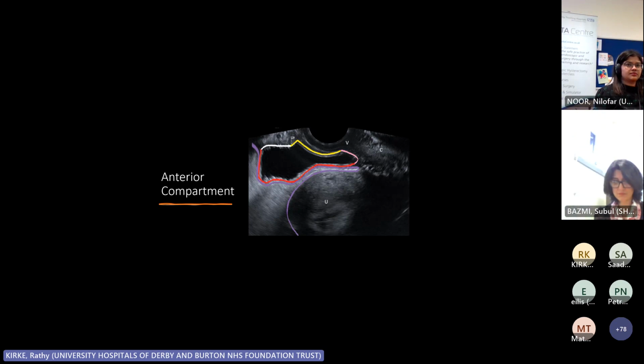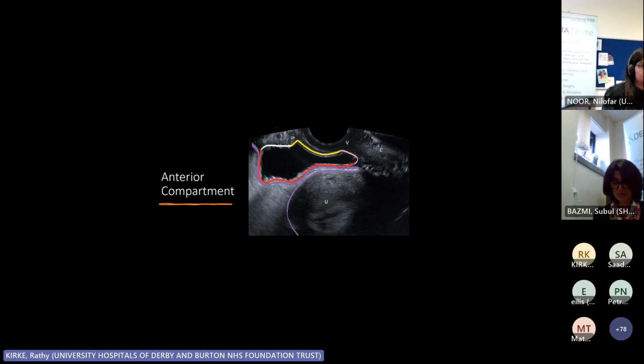Someone recently told me that when you scan a patient for endometriosis, think like a gynecologist. I thought that was too complicated for me. I thought, no, thank you. I'm just a simple radiologist. But I think it made sense, because that's what you do with an internal exam. They move the uterus, they're feeling the posterior space, the anterior space. That's the sort of feel you try and get with the ultrasound. We look at the anterior compartment and just get a feel of how is that uterus? Is it moving? Are the pelvic structures sliding around, or is everything fairly rigid?